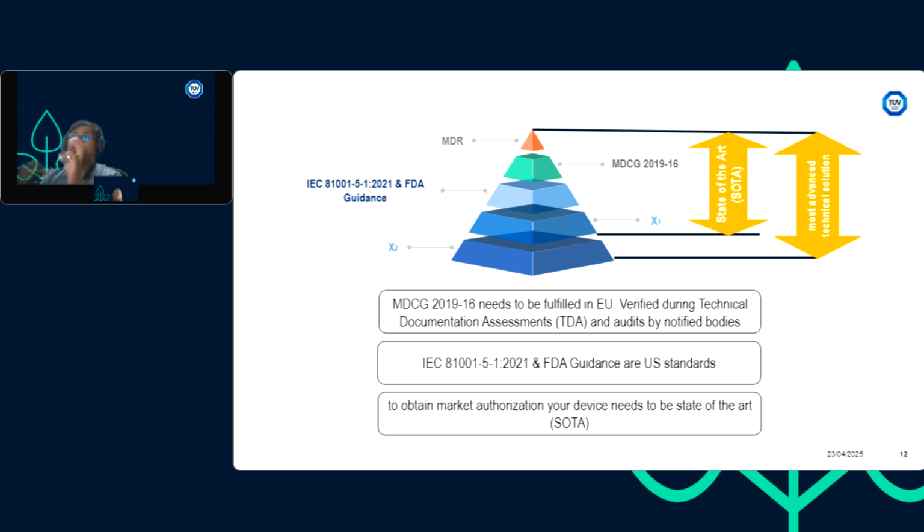If we are changing any particular component, or adding any component into the system, we just need to quickly make sure that we are running it through threat modeling, we are running it through code scanning, we are doing sufficient, adequate testing for it, and then we are putting it in the post-market phase as well. And this cycle keeps running every now and then.